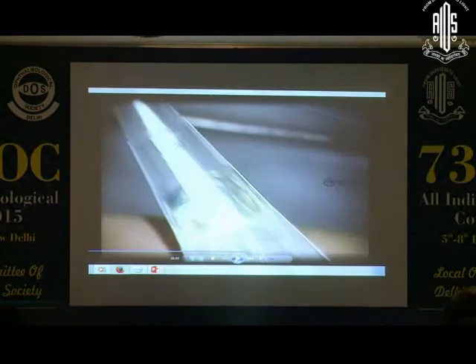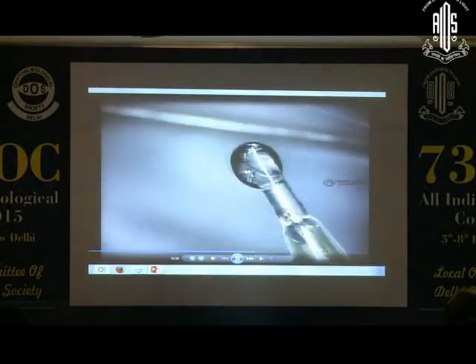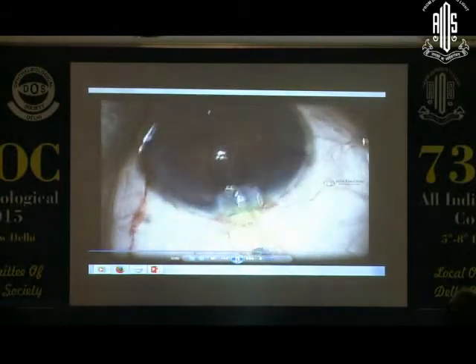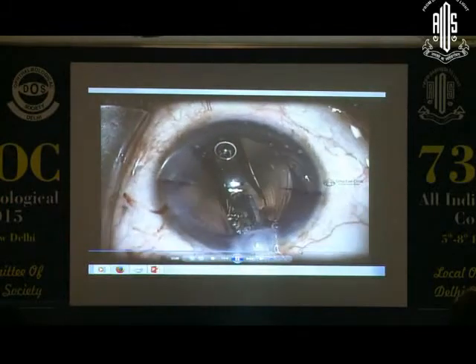Here this lens is preloaded again. As Dr. Atik said, it has the haptic tips made of PMMA, giving it some kind of advantage. It doesn't stick to the lens surface and apparently prevents unwanted rotation. Towards the back.